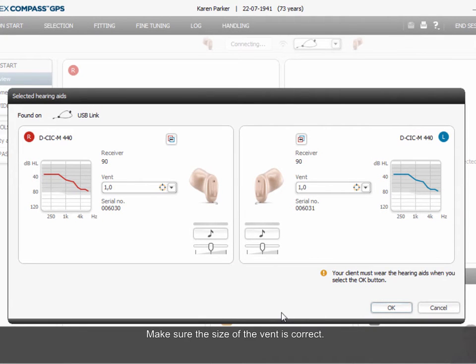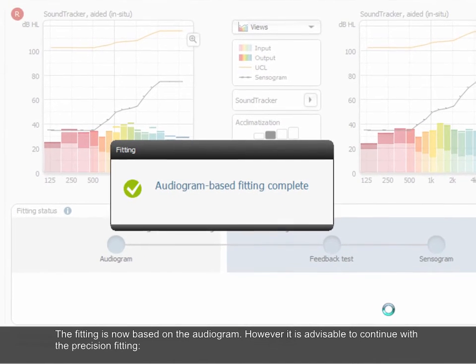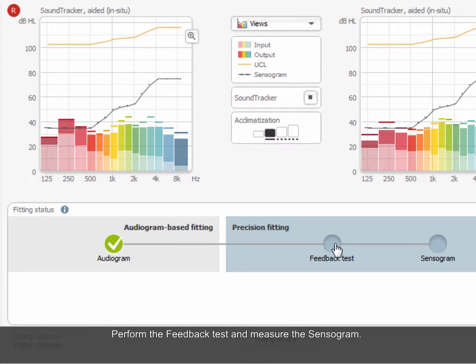Make sure the size of the vent is correct. The fitting is now based on the audiogram. However, it is advisable to continue with the precision fitting, perform the feedback test, and measure the Sensogram.